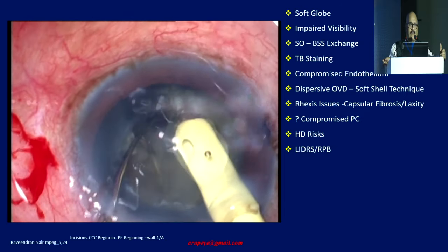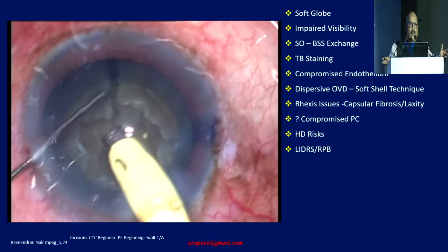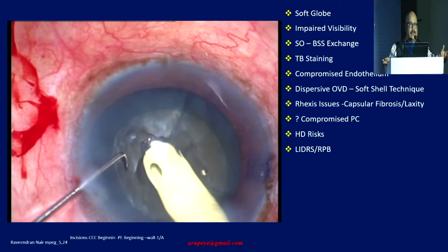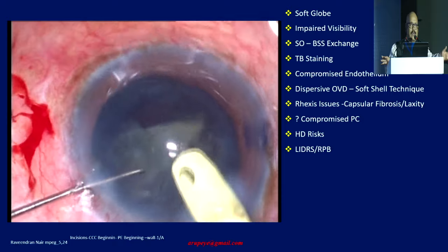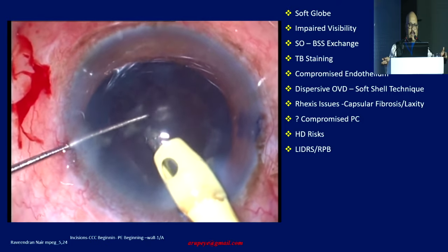It is not necessary for you to split the nucleus into two equal halves at this stage itself. One should use any technique that he or she is comfortable with, whichever technique in your hands you feel is most capsular zonular friendly. So this is working pretty well. This is a hardish nucleus, grade 4, so I'd split it up into multiple pieces that has been edited out.